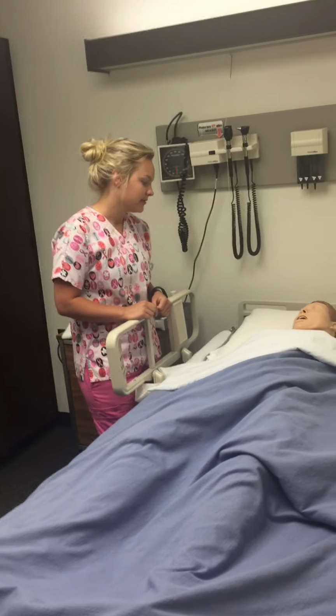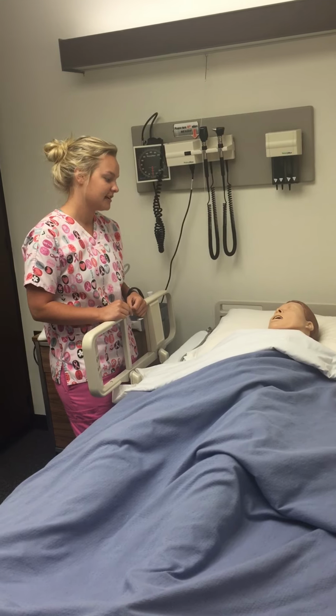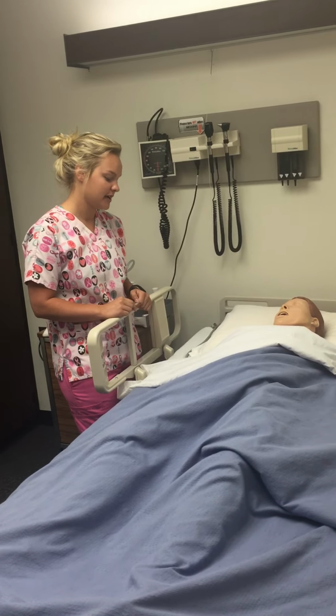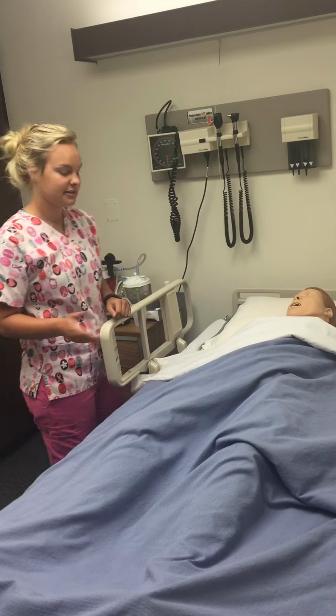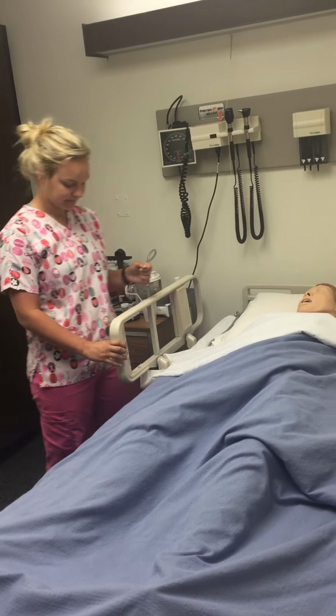I gave you a pain pill about 30 minutes ago. How would you rate your pain? 2 of 10, is that acceptable? It is, okay. Well, I'll just get my supplies ready and then we'll change your dressing, okay?